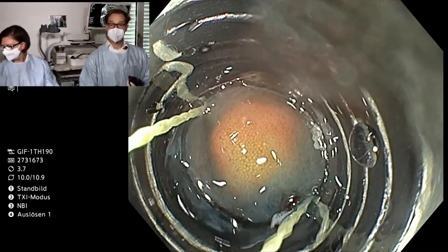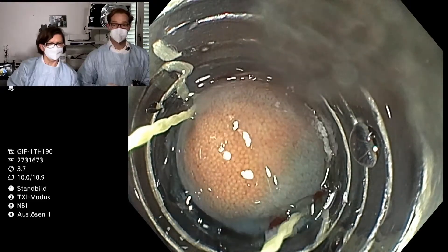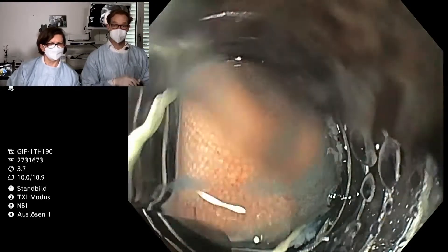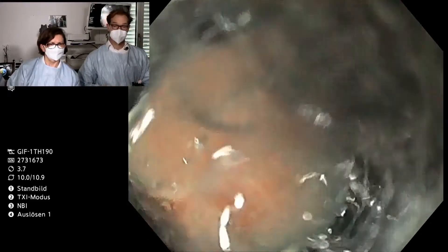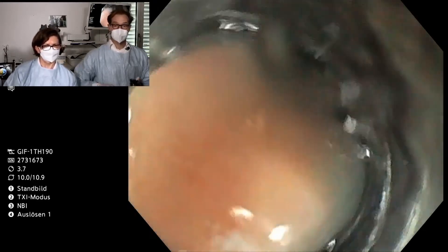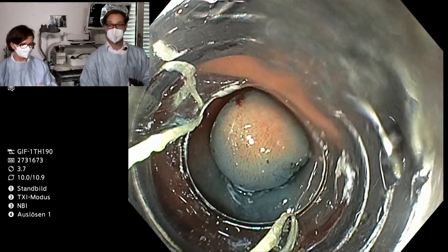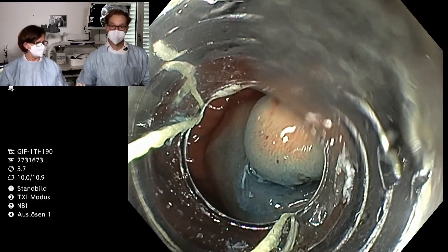Now I am going a bit closer and pressing my endoscope onto the lesion and starting to suck. I get the lesion close to my lens and now I am firing with the first ring — the only ring I will fire. I can already see the lesion is completely in the ring, so it looks perfect.